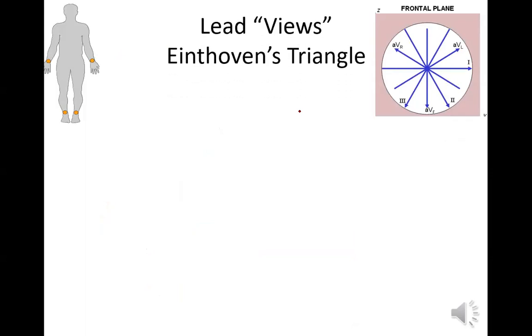Rotation. So here's Einthoven's triangle, which is based on the 3 bipolar leads. So if you look at this, I really like this drawing. I like to make sure you know the SA node is there. Draw plus signs and negative signs for the leads, like lead 2, lead 1, negatives, right? And then positive electrode and positive vector, really, for lead 3, so forth, so on, AVR, negative, positive, AVL, positive up here.